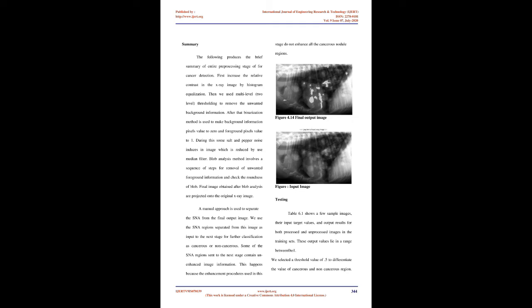Receiver operating characteristics. Relative, or receiver, operating characteristic, ROC, analysis is an analytical procedure for measuring the accuracy of a system. ROC curves show a relationship between the true positive probability and the false positive probability. The evaluation factor is the area under the curve, Az. Figure 2.2 is an example. ROC provides a desirable index of accuracy and the appropriate basis for an index of efficacy.